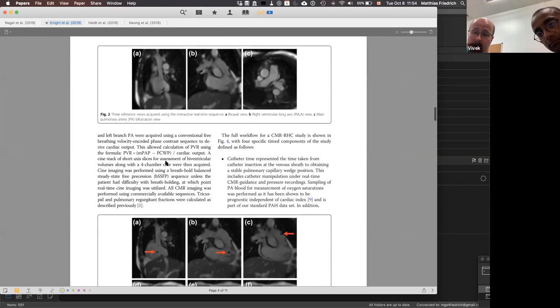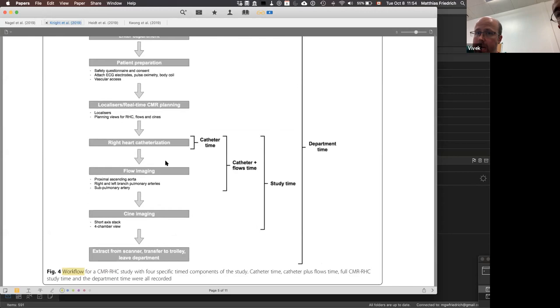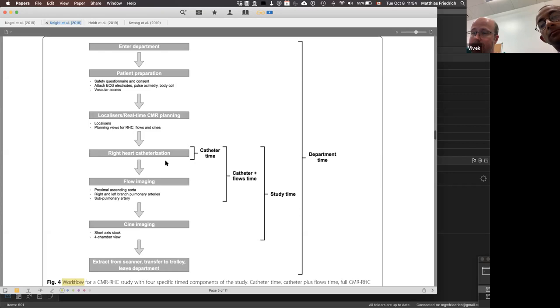Just before I go on to the imaging itself, in terms of patient prep, we actually start with the patient on the table to make sure we get the ECG electrode with a decent signal and pop the coil on. Because when we then detach the table and move them out of the scanner, just outside the scanner door, we have a little prep area. We want to make sure that once we've done all the sterile drapes, we have a good ECG signal at the start. We don't want to have to undo all that.